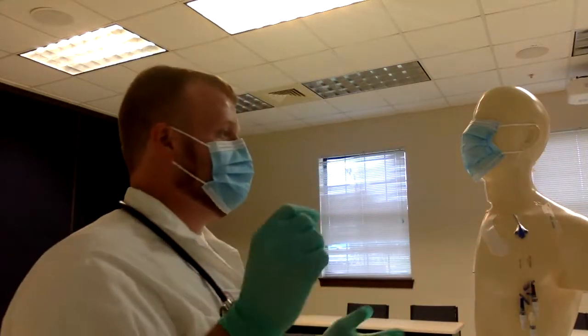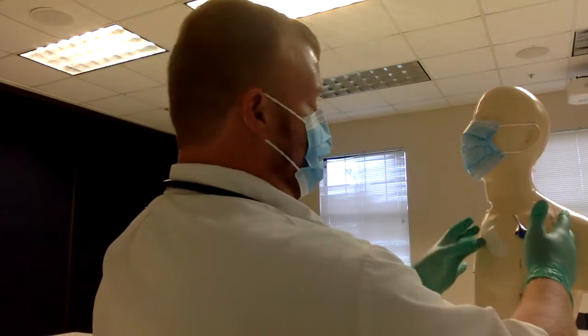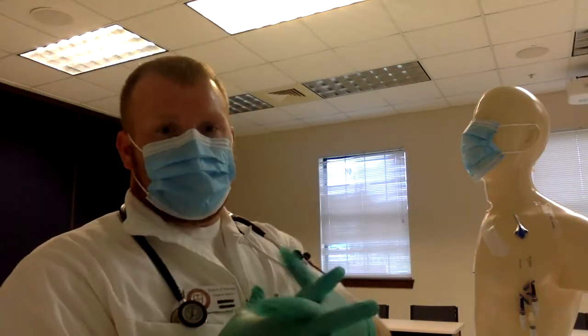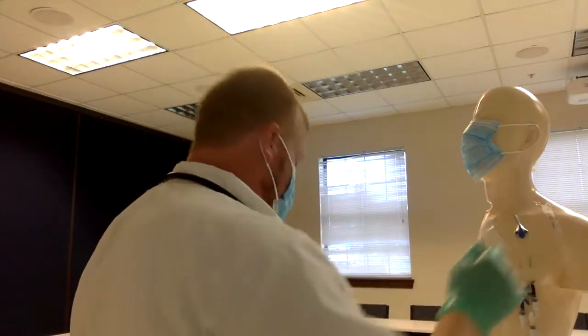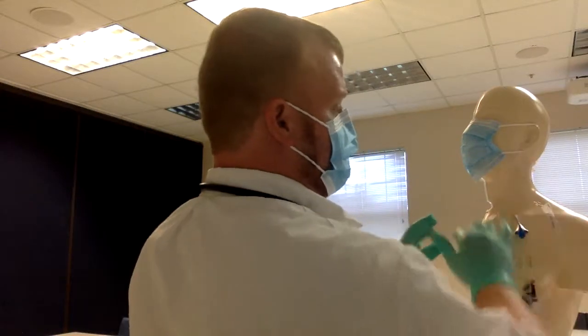You want to make sure that you initial and date it, because then the next person coming through can see, okay, in 7 days I need to change this. So that's this clear one. Some policies say you have to have another dressing on top of this, a gauze dressing. So this is all sealed up, name, date. You have a gauze that goes right here, and you just tape the edges around it.